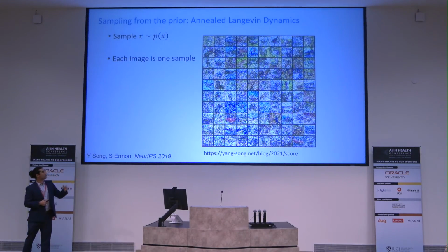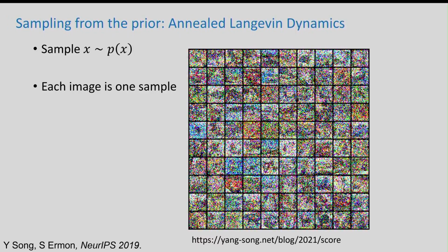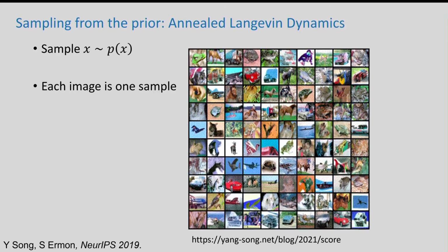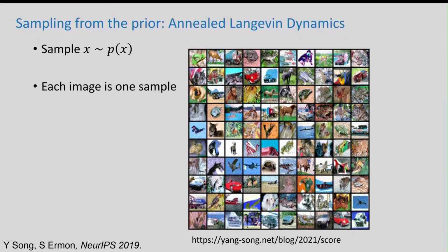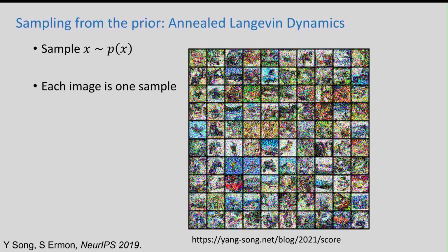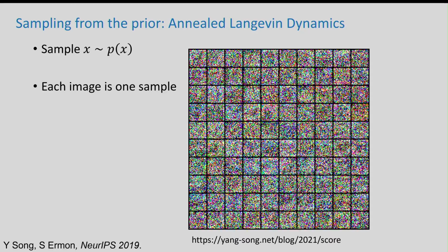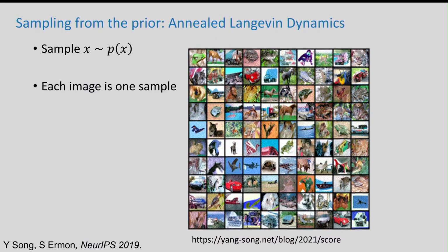And so this is showing using score models for generating new images. So it starts with pure noise. And every time we run it through our model, it tells us, hey, update the image to look a little bit more like what I know to be true images. And this was trained on images from a particular computer vision data set. And so by running the algorithm, starting with pure noise, I can generate new images from my distribution.